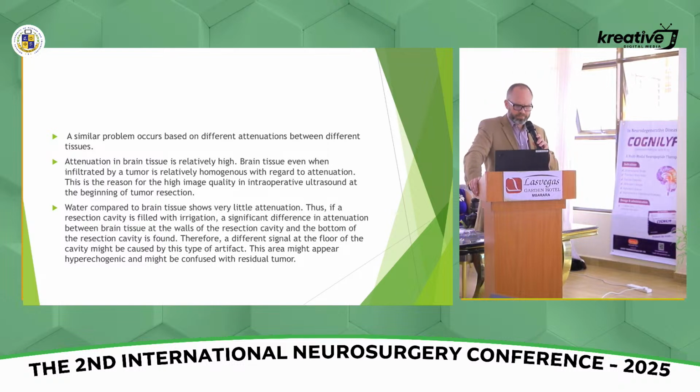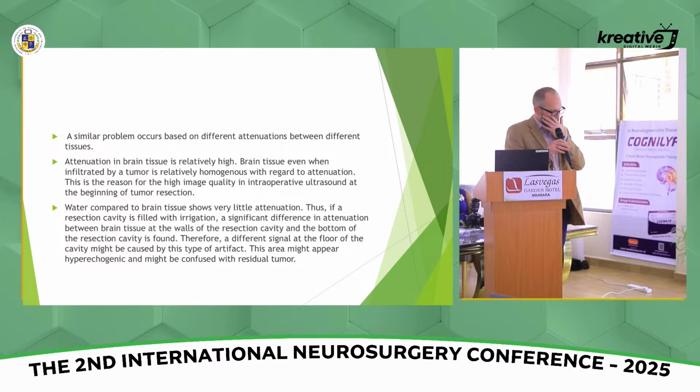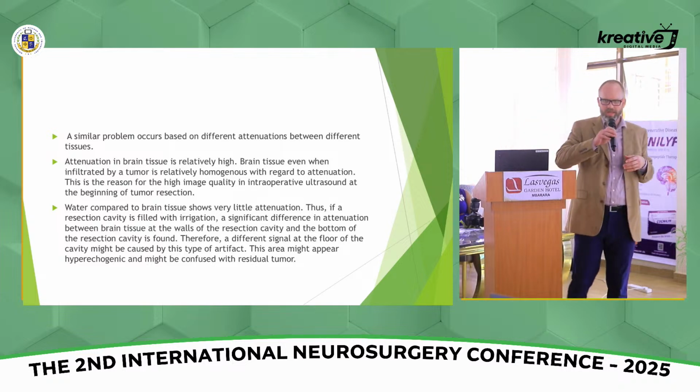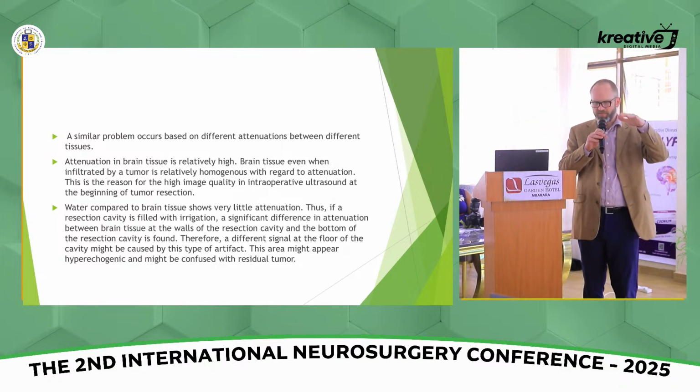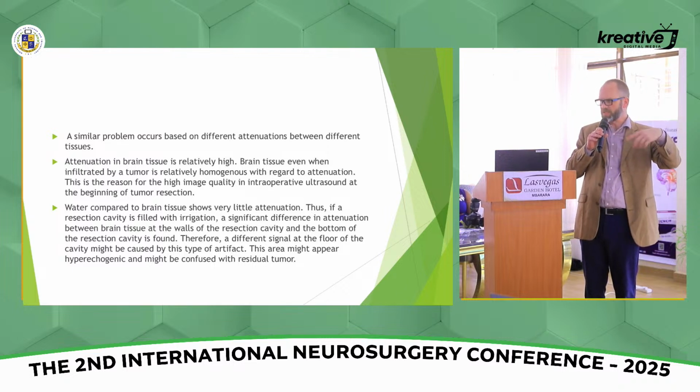And water has very little attenuation, so it can be really helpful. Sometimes you want that, but sometimes you want to see without that water artifact. So even if you have a fluid-filled cavity, if you're concerned, you're like, is that tumor residual or is that artifact?